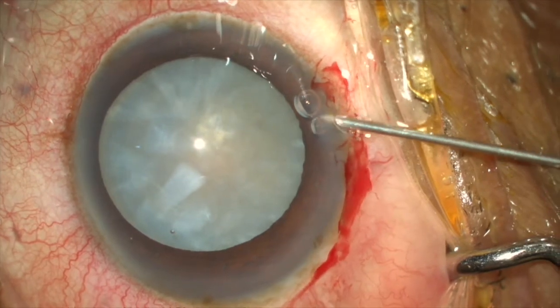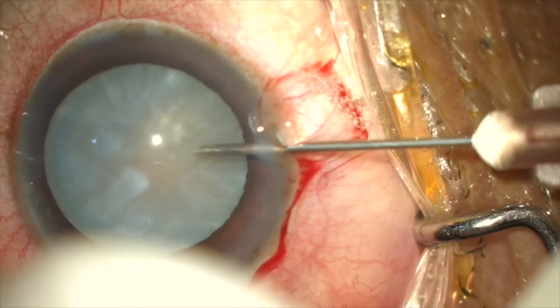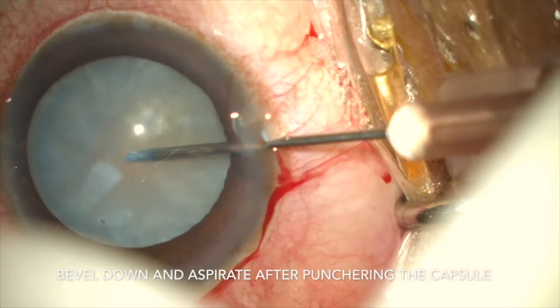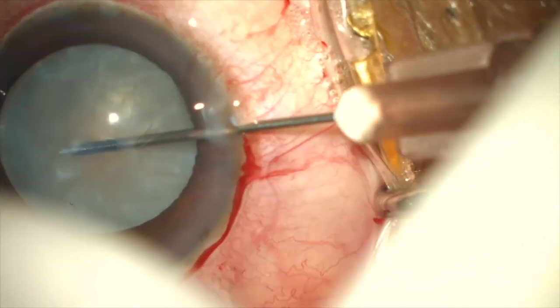We take the 26-gauge needle with some saline filled in the syringe, in case the capsule gets stuck and you want to flush back — like a reflex in phaco. As you pierce, slowly start aspirating in the bevel-down position, as the anterior lens capsule will get stuck if the bevel is facing upwards.